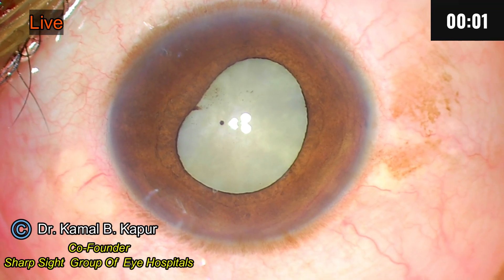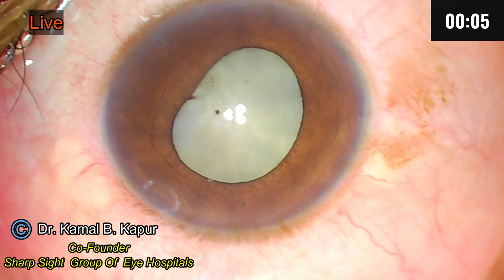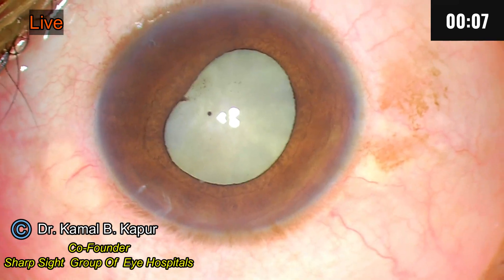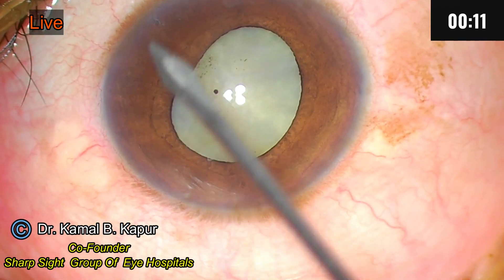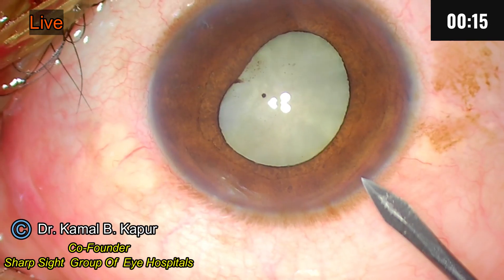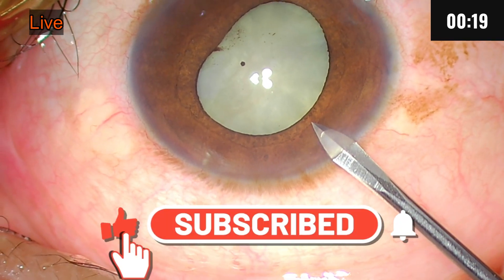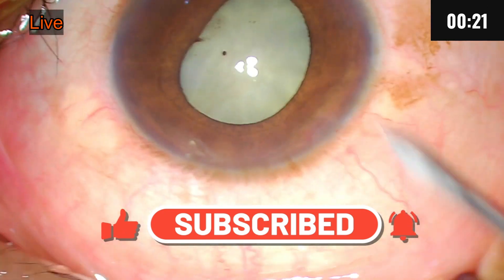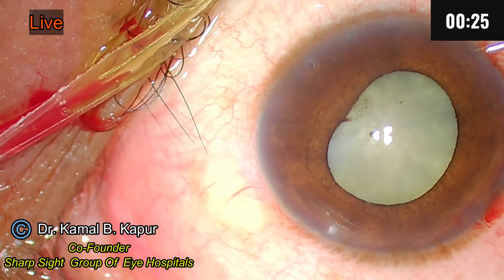In this case of phacomorphic cataract with phacomorphic glaucoma, the IOP was very high. We had to perform a peripheral iridotomy. If you notice, there is one mark here and one mark here — the chamber was very shallow, totally flat. This is after a couple of days of performing the iridotomy.